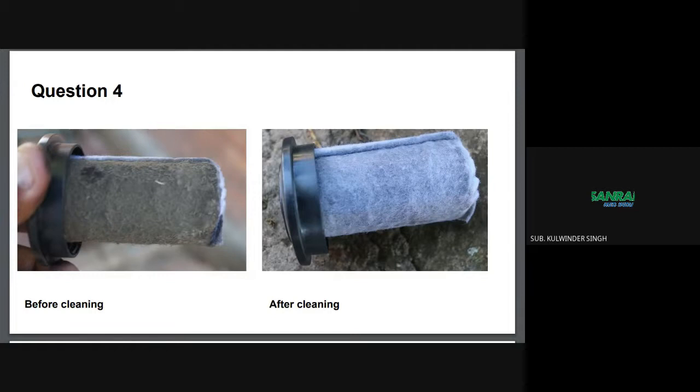Okay, thank you for the question. So the answer is no. The concentrator should not be used without the intake filter, because the filter is a very important part in the system. So all the dust particles and humidity are separated by the filters. Every make and model of concentrator comes equipped with an intake filter. There are 2 filters inside the machine. One is the cabinet filter, the other is the fine filter or the HEPA filter. So they have their efficiency of filtering the air.